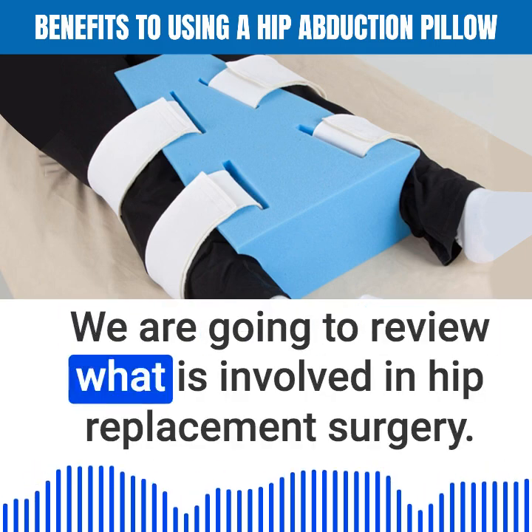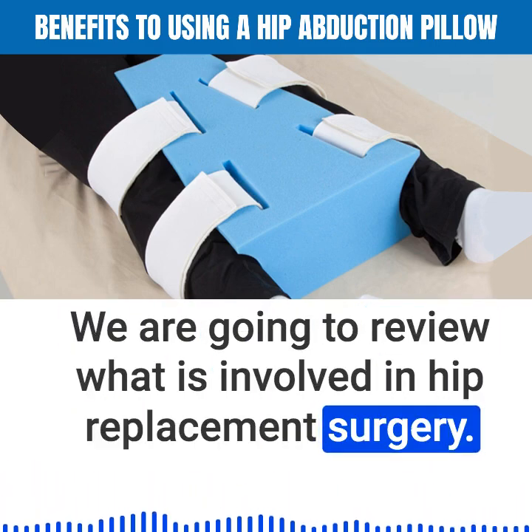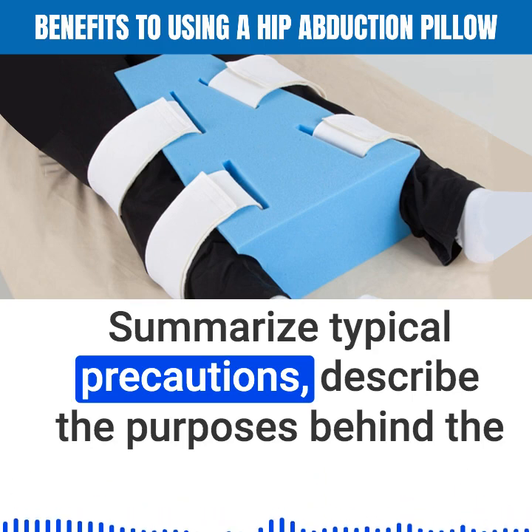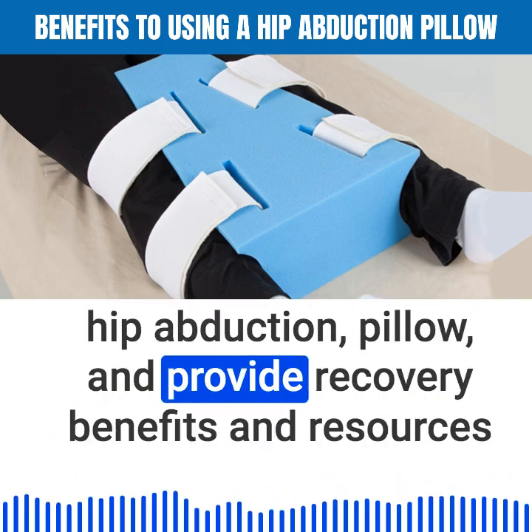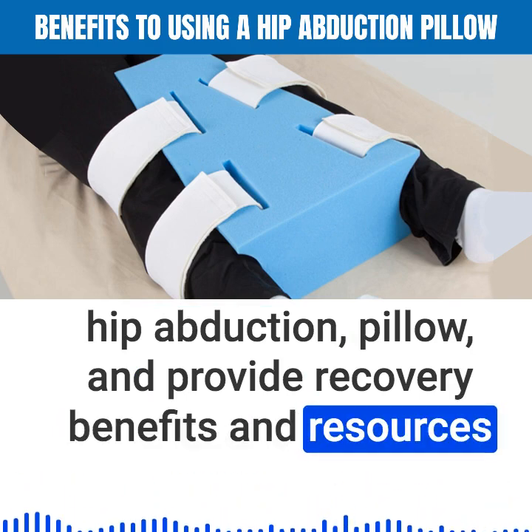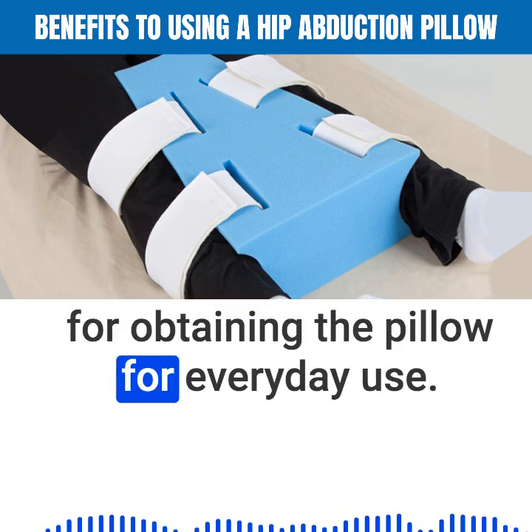We are going to review what is involved in hip replacement surgery, summarize typical precautions, describe the purposes behind the hip abduction pillow, and provide recovery benefits and resources for obtaining the pillow for everyday use.